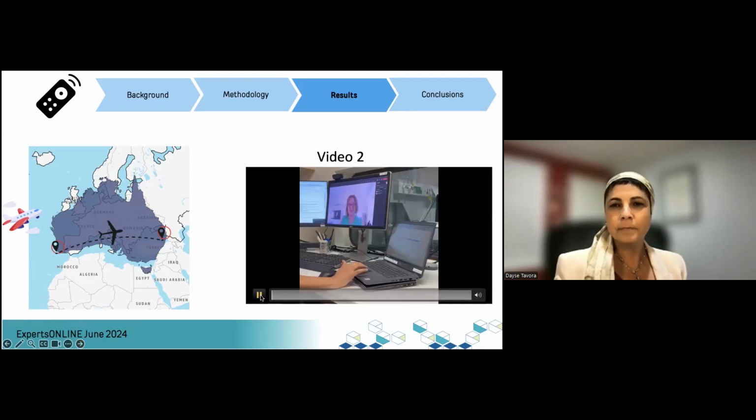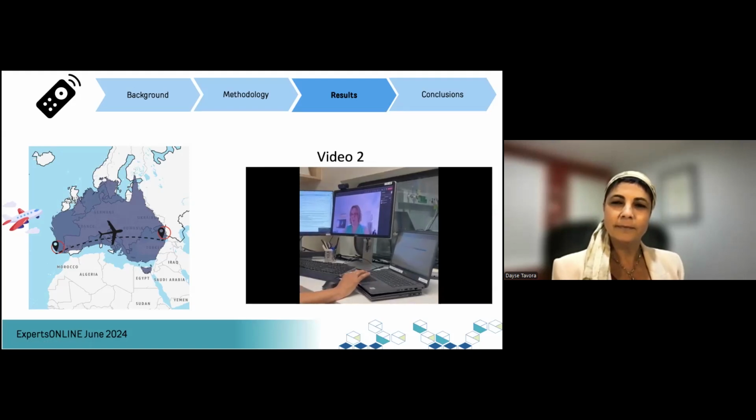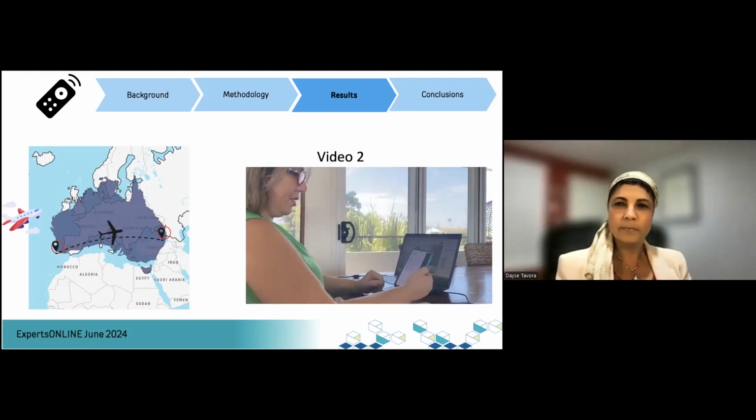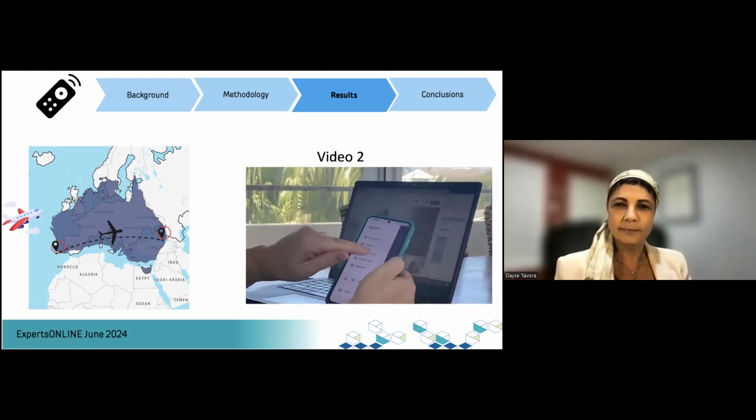So it is my understanding that you have the app installed and we are pretty much good to go. It's on my phone. Perfect. Now we should be able to do the system check. Okay. So if we do that. Yeah, so I've just gone to the little icon in the corner and system check.